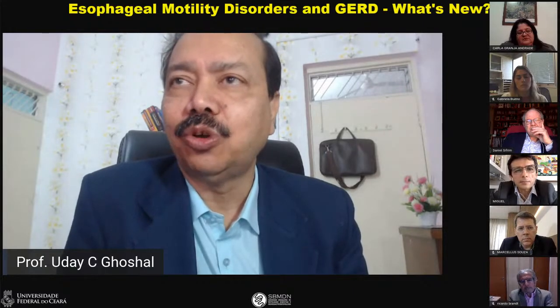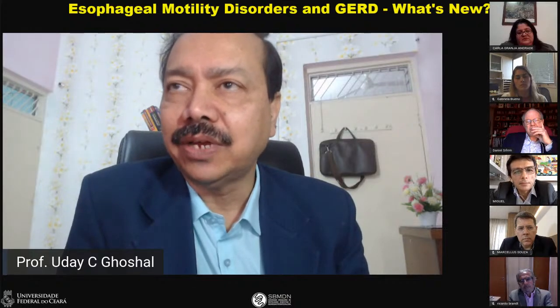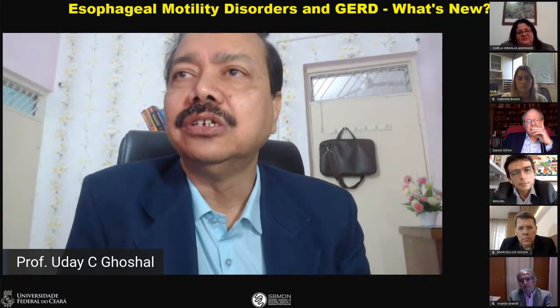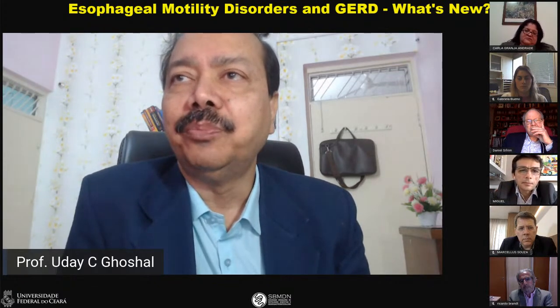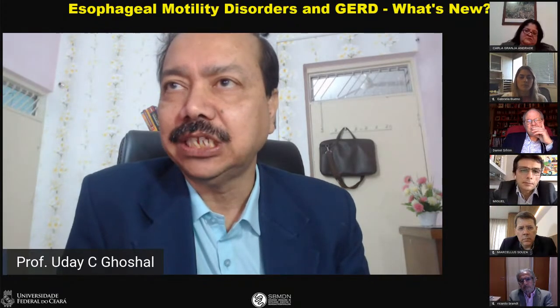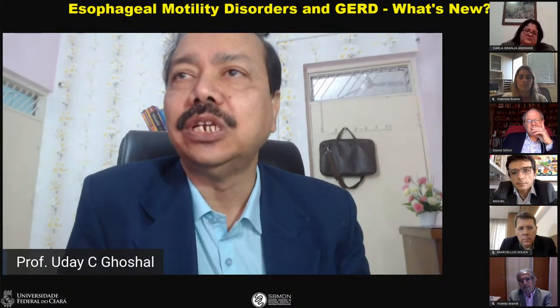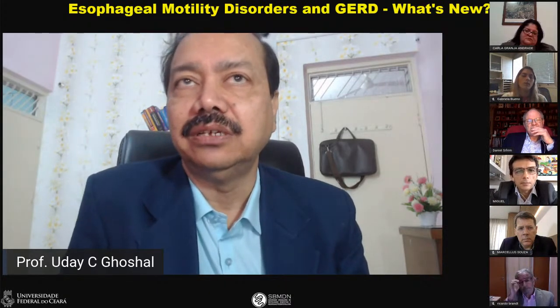It is just an antibody positivity, and we found in areas of India where the disease is very endemic, as high as 10 to 20% of healthy people develop antibody without ever experiencing symptoms of COVID-19. So this is what I thought. Yes, the patient has marked hypomotility involving the esophagus, something like myopathic changes in the esophagus, along with the low LES pressure, which suggests muscle involvement at the esophageal level.